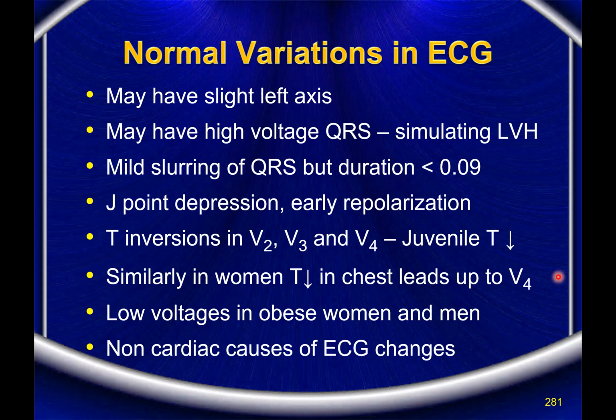Deep inspiration recording will push the diaphragm down. Ask the patient to take a deep inspiration and then hold the breath in deep inspiration. When the diaphragm is down, then you take a record, and if that shows T waves upright, even if the T waves are inverted when he is lying flat, if in deep inspiration T waves are upright, then that excludes any organic change.